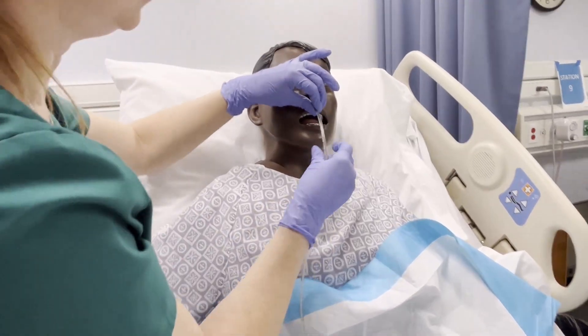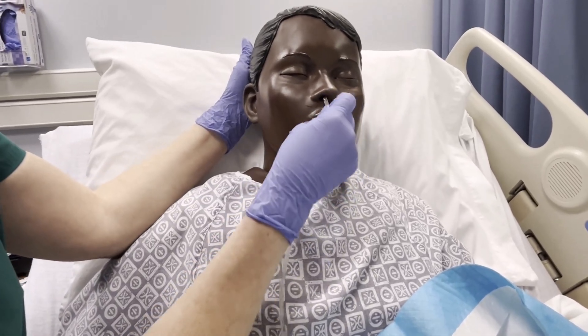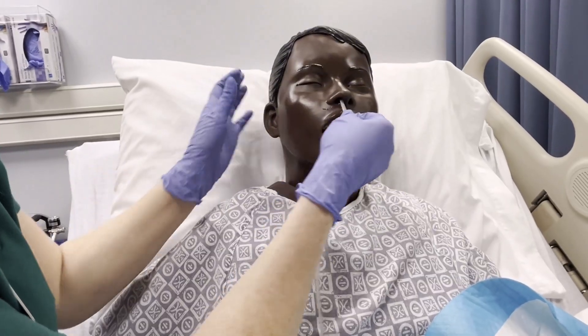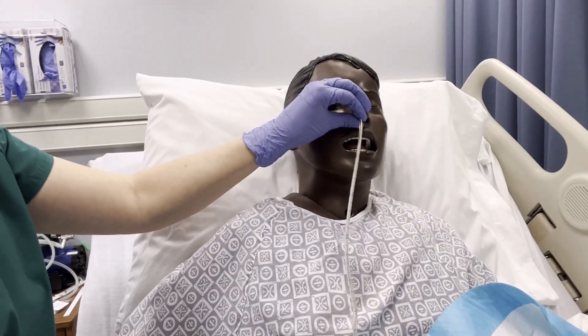We're looking at our mark. I needed to go between the 45 and 50, so I'm going to continue to feed it in — about 45, right there. This is where I want to keep the tube.